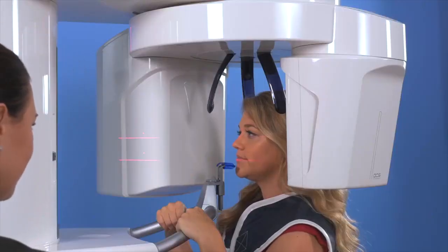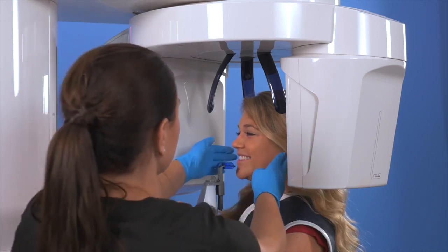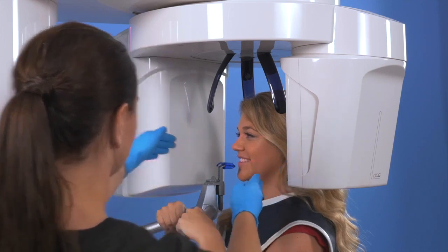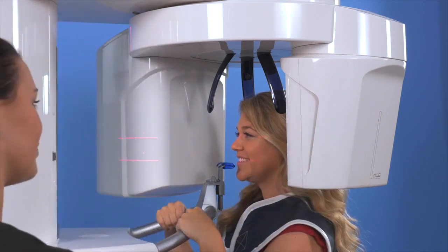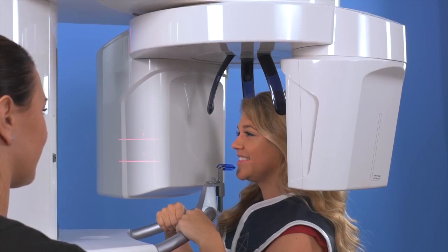Have our patient smile for us, noting that the occlusal plane should be parallel to the floor. Note the positioning lights and lower them slightly to make sure the lower light is touching the top of the lower arch. The upper light will then be positioned above where the roots are positioned.